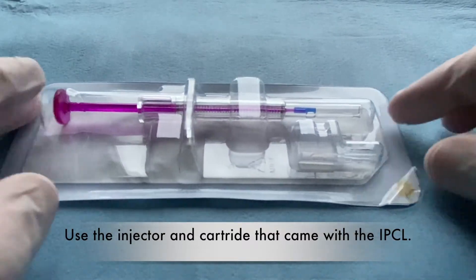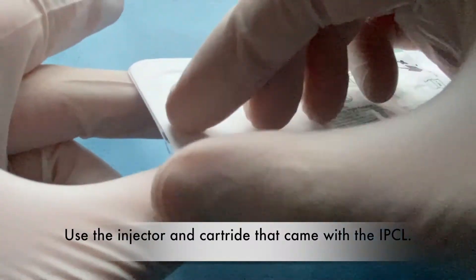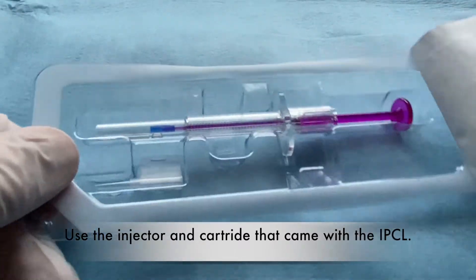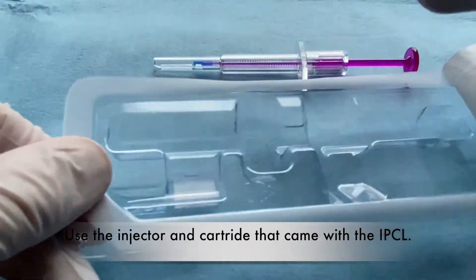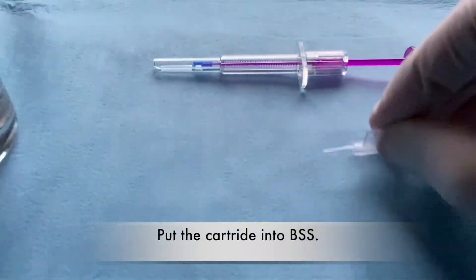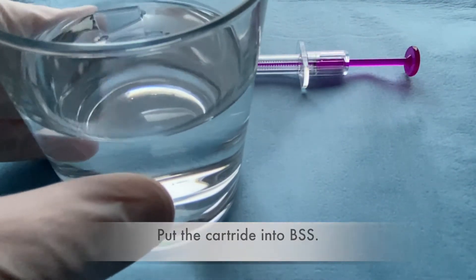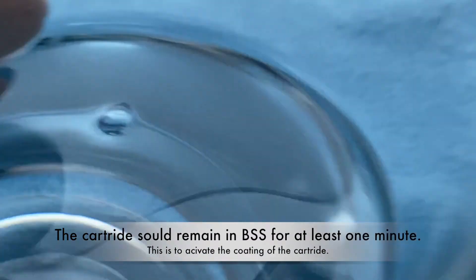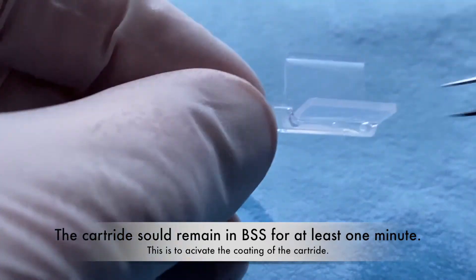Use the injector and the cartridge that came with the IPCL. Put the cartridge into BSS. The cartridge should remain in BSS for at least one minute. This is to activate the coating of the cartridge.